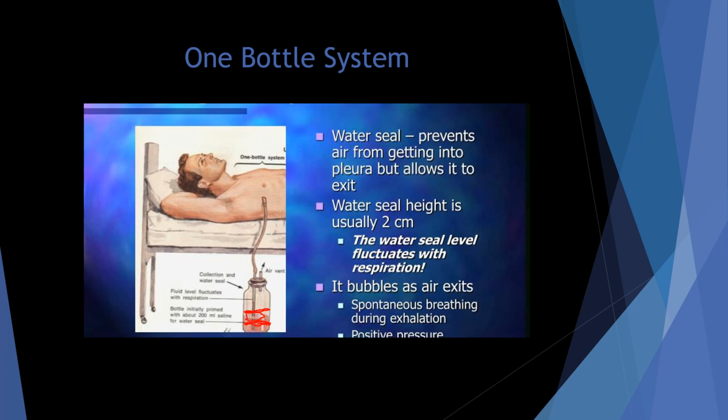What if it goes higher up? There we go. So what if that fills with blood now? If it fills with blood, we have changed the hydrostatic pressure that the lung has to overcome in order to get the air out.